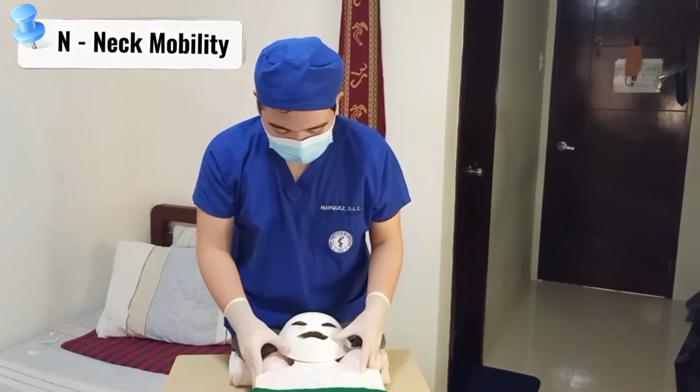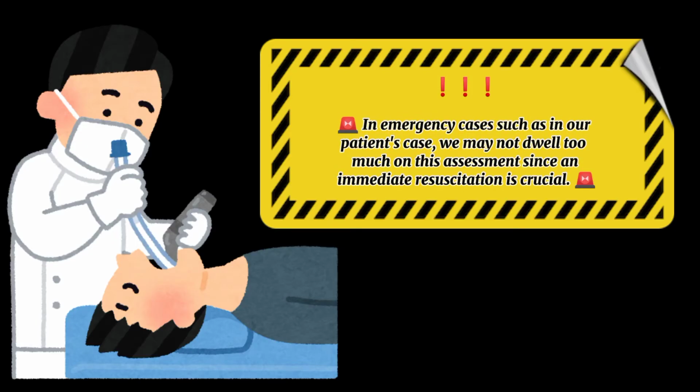Normal flexion is about 30 to 35 degrees. However, in emergency cases, such as in our patient's case, an immediate resuscitation and intubation is crucial. Hence, we may not dwell too much on this kind of assessment.